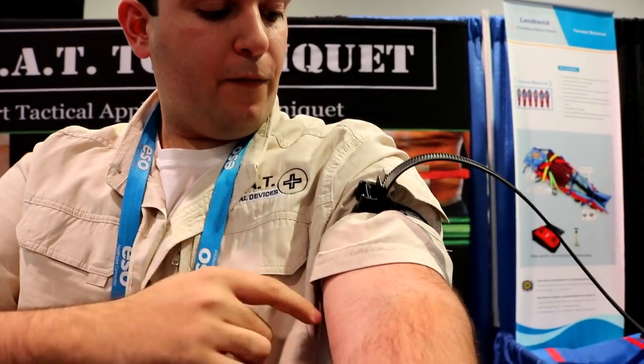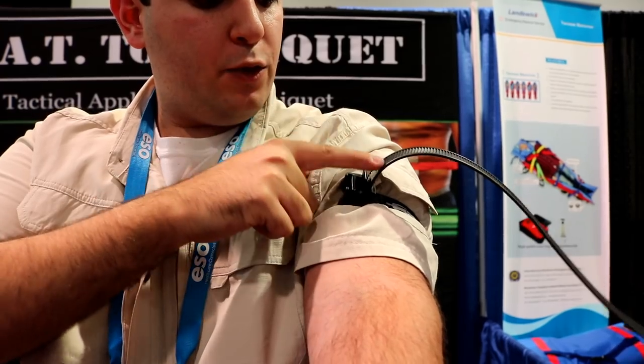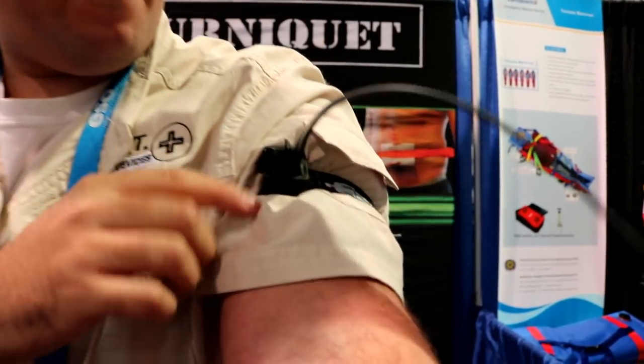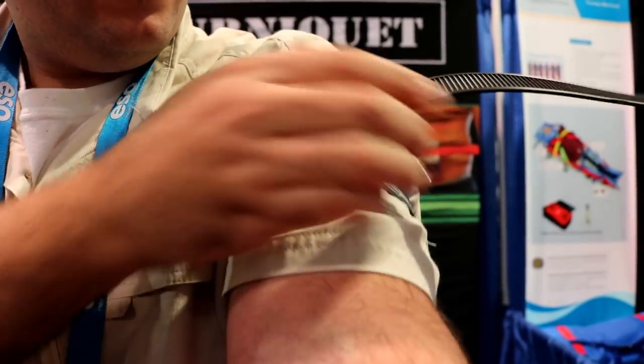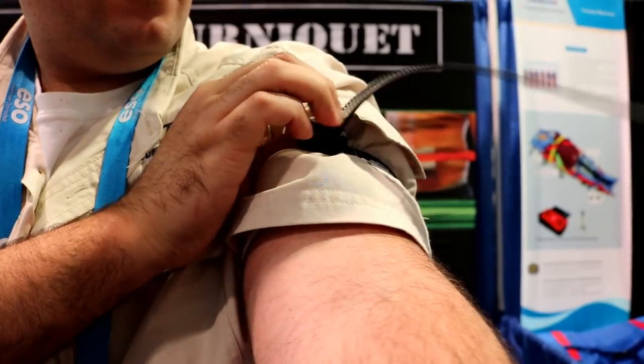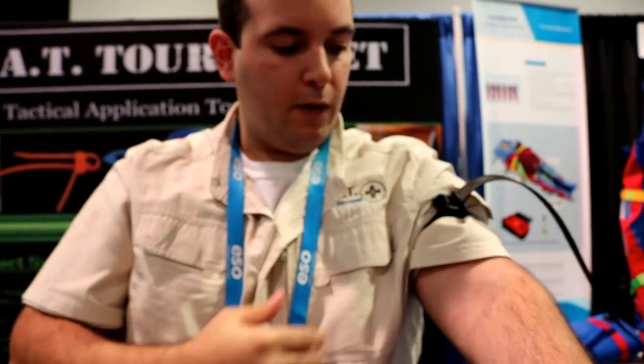To release it, for a trained professional, you have to jam your finger in between the strap and the release lever and pull this way. When there's a lot of pressure, you'll hear a click. I'll do it tighter just so you can hear — you hear that little small click. You'll know it's been releasing some pressure.